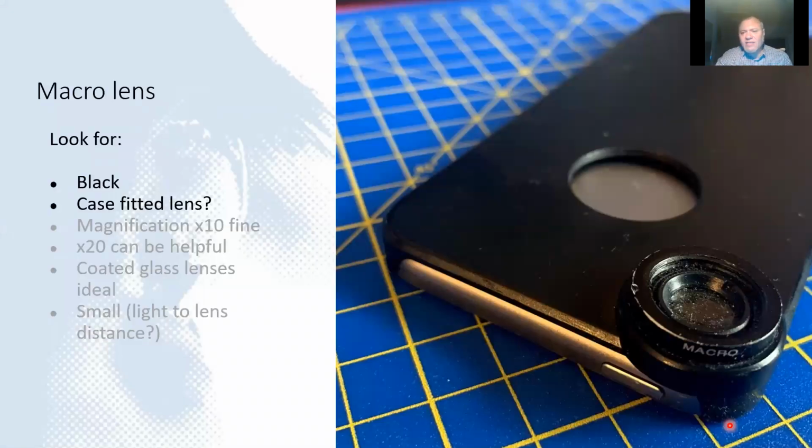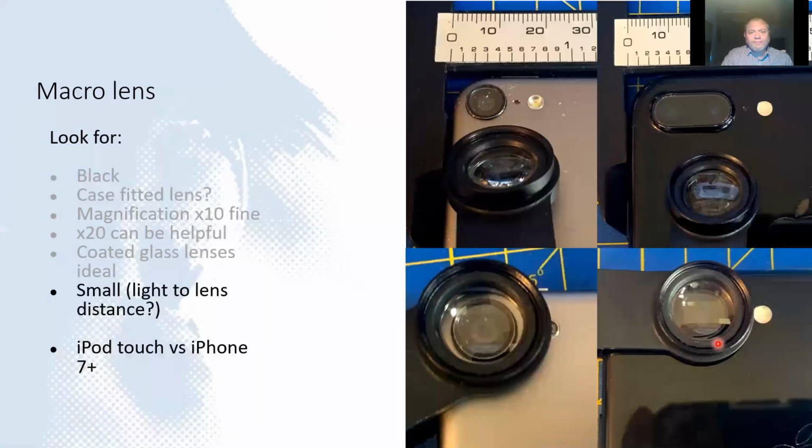To mention case-fitted lenses, you can get cases for your phone with the lens attached. It's a very convenient way of adding your lens to it.